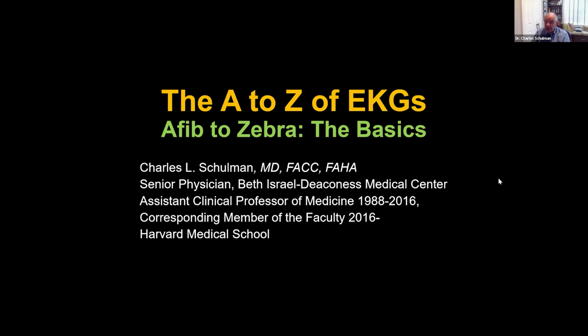This is the first of a series of ECG talks. There are 3 talks. This is number 1, and what I do is start with the basics, and we'll go from there.